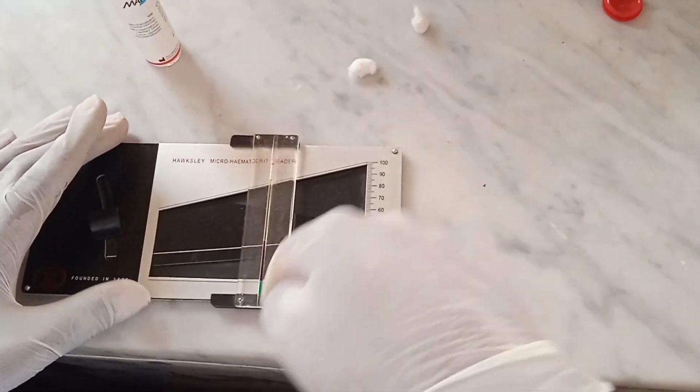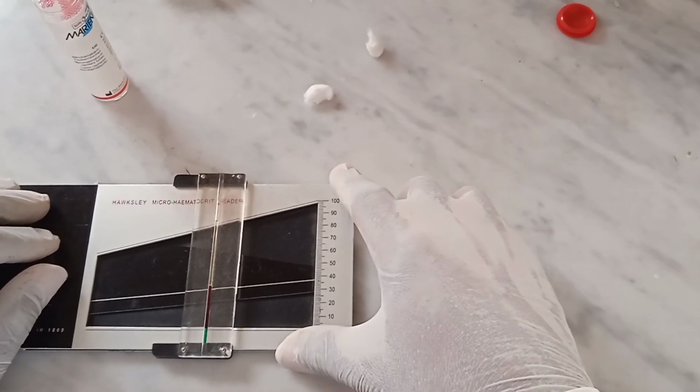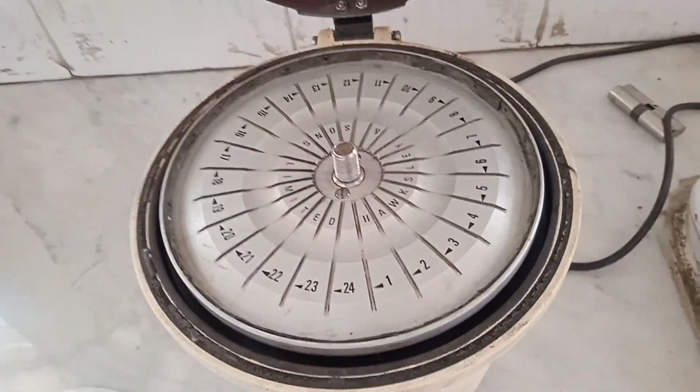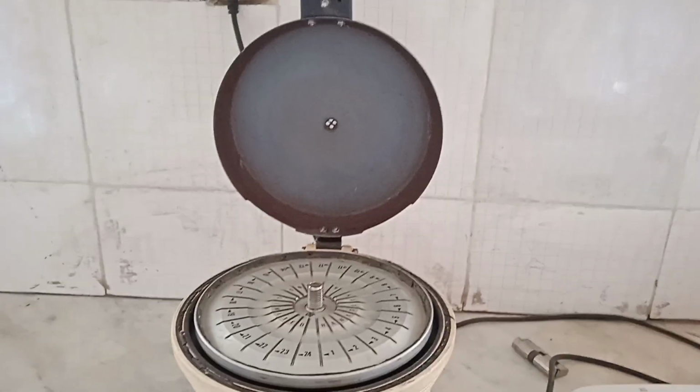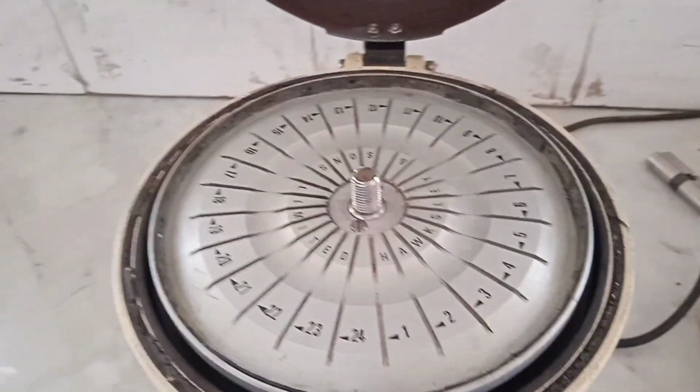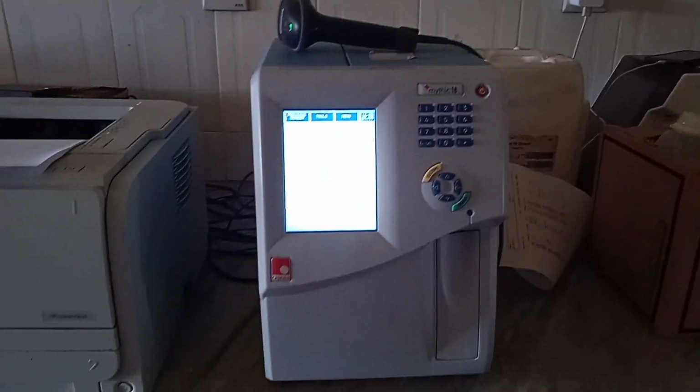After you must have centrifuged the blood in that capillary tube, that is that tiny stuff, it comes out in this form, and this is the centrifuge that is used for the packed cell volume. This is how it looks, and you put your capillary tube, balance it and spin it and all that. So this is our auto analyzer.